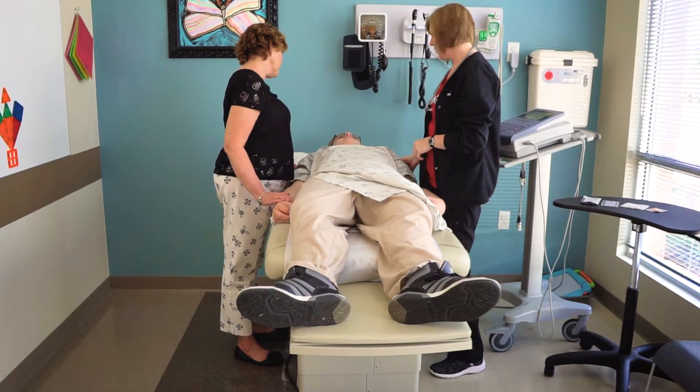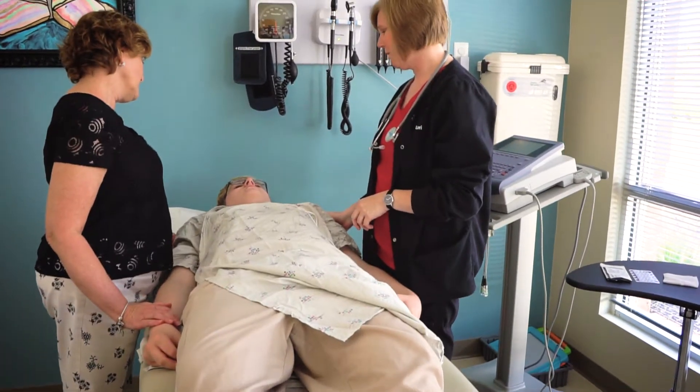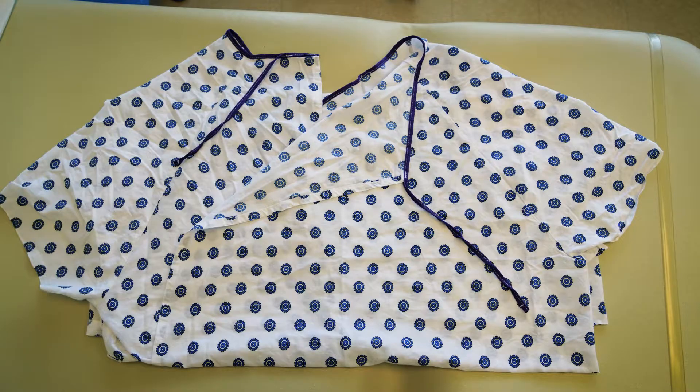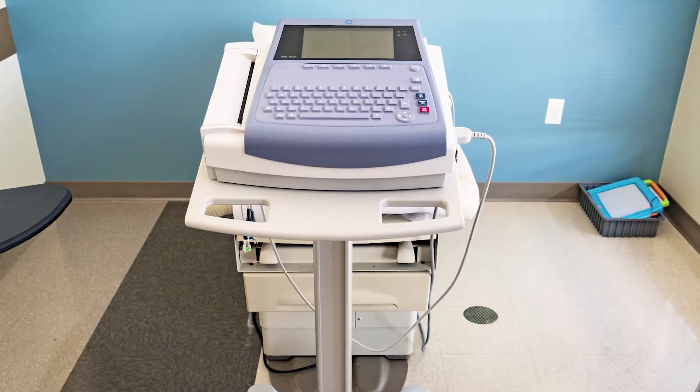Before you begin the EKG, take a few minutes to review the equipment you will be using. Demonstrating the machine may help to alleviate any anxiety or concern the patient may have. Allow the patient to touch and see all the items that will be used during the EKG, and encourage questions. This may be the first time they have seen leads and gowns, so a quick review and exploration of these items can prove helpful.